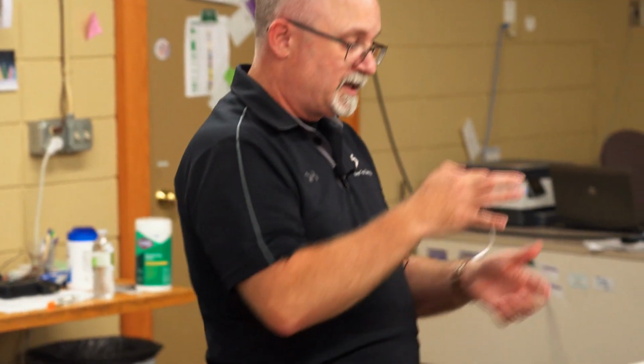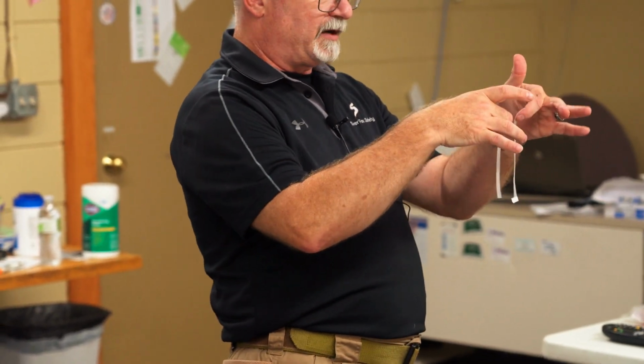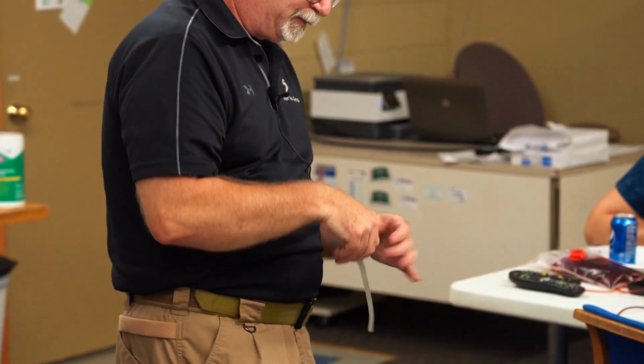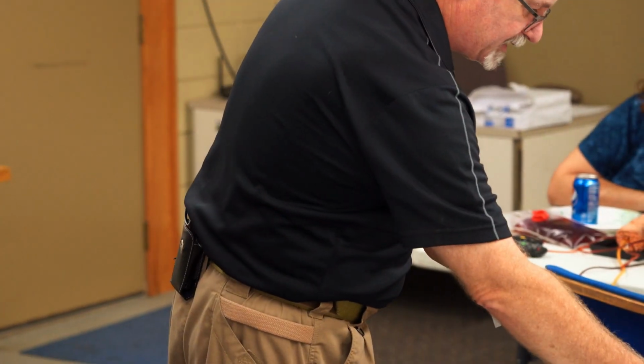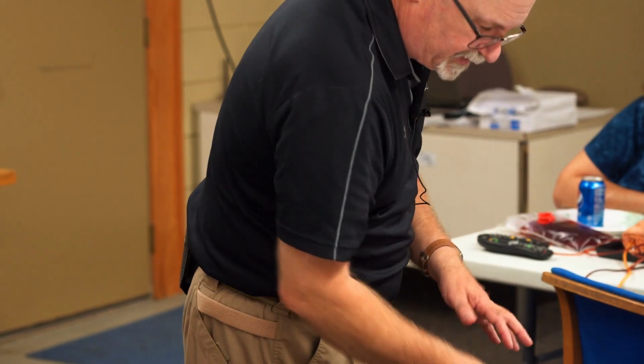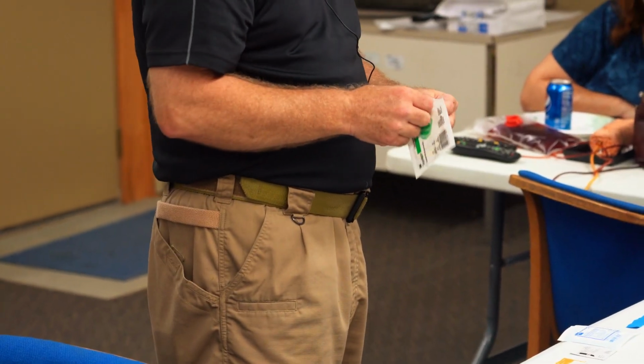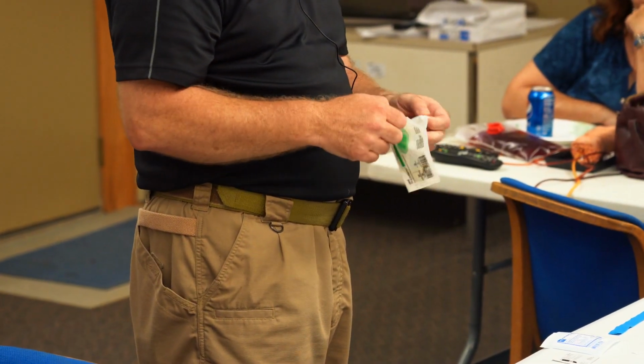In a lot of cases, I actually do most of this before I get my gloves on. So for me, I tear it again because I don't need all that much surface area, but I do need still some tape. So I'll usually tear 2 pieces up like this, but you guys can play with that as you will tonight as we start poking things. Okay, so there's my tape. You want all of this stuff prepped before we get to the next step of the actual needle.